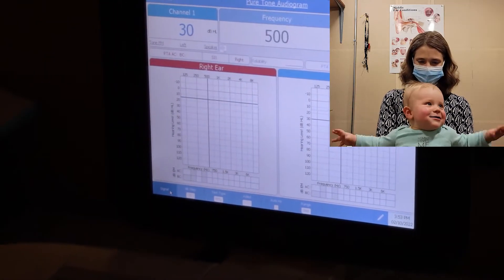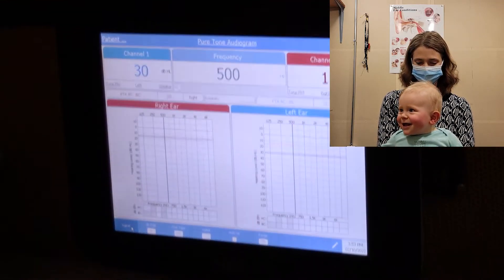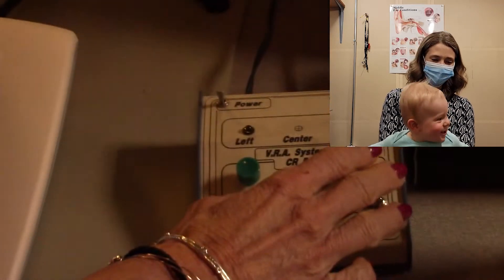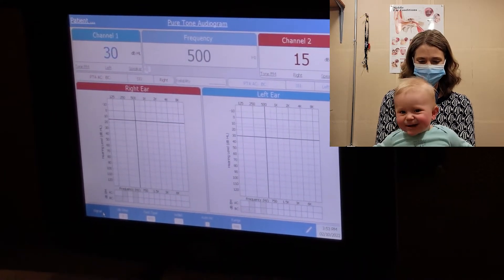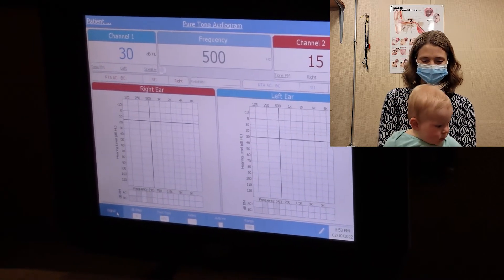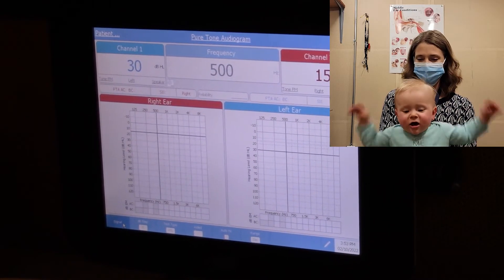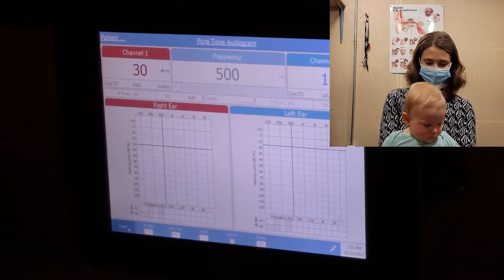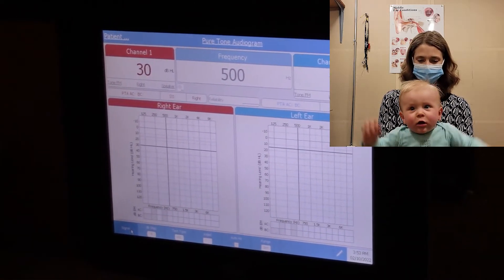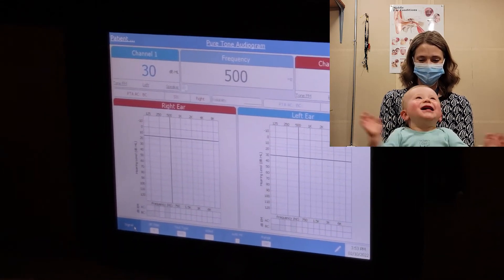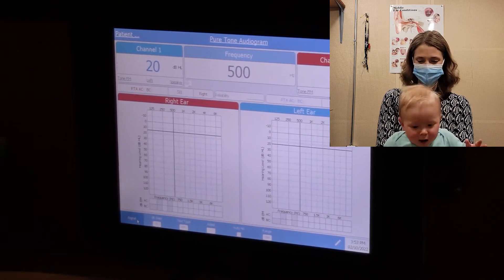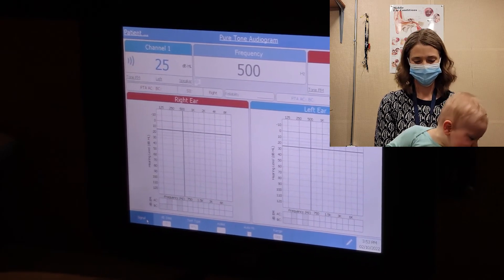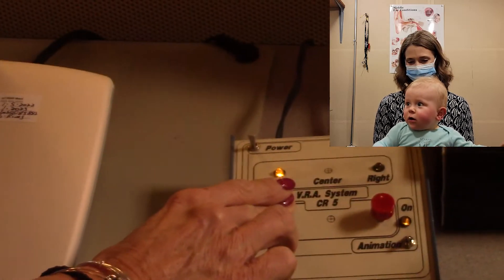Okay, let's go 30 dB at warble at 500. We're going to go to our left. And now we'll go to our right. I don't know if he just looked that way. Mom's going to burn like 1,000 calories in here. Just hanging on to him. Good grief. He's going to fly. Okay, we're going to go to our right. Oh, that was really good. He saw him stop and he looked that way. That was at 30. So now we're going to go to 20.